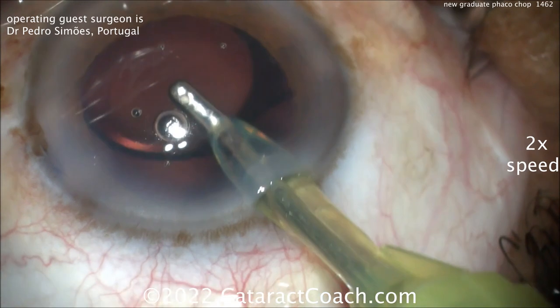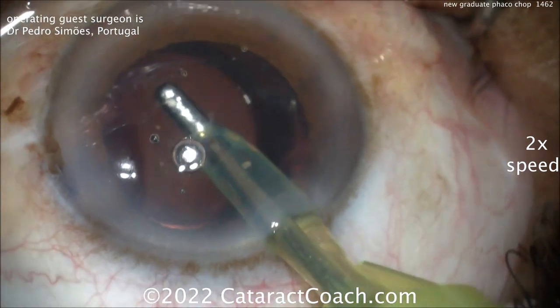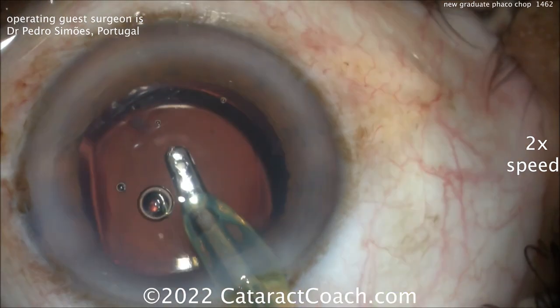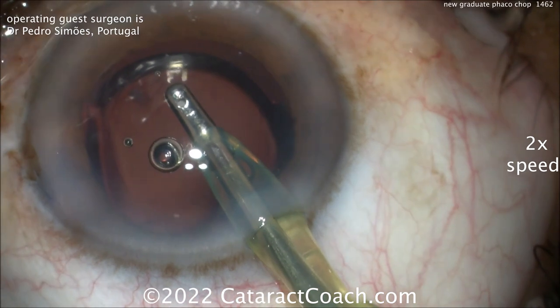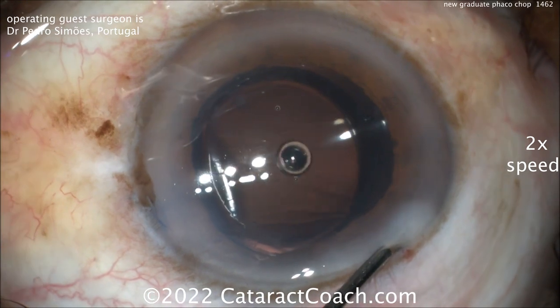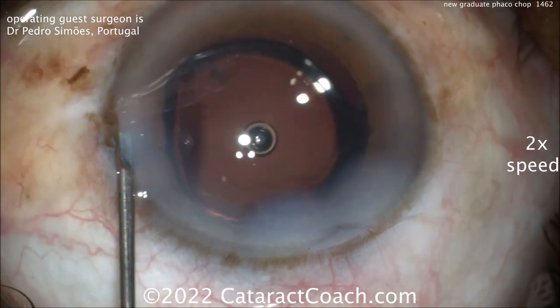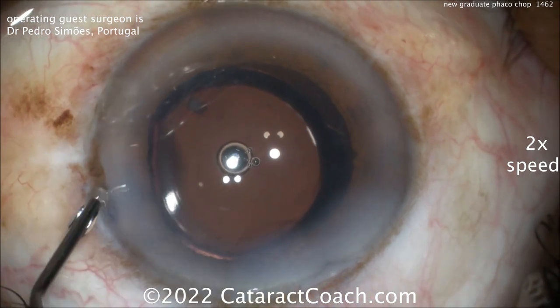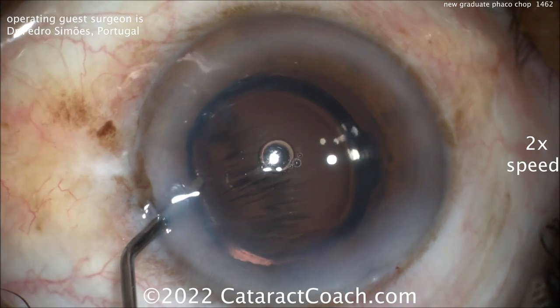Removing the viscoelastic from behind the eye — very nicely done. Wow, this patient is going to be so incredibly happy. You're taking this patient from terrible vision to fantastic vision. Very nice result here. I commend you — beautiful job, Dr. Pedro. Keep up the good work, and just keep those few pearls I gave you in mind: keeping the eye in primary, maybe adjust that incision a little bit. But I really like your technique, and I think you're a fantastic surgeon.